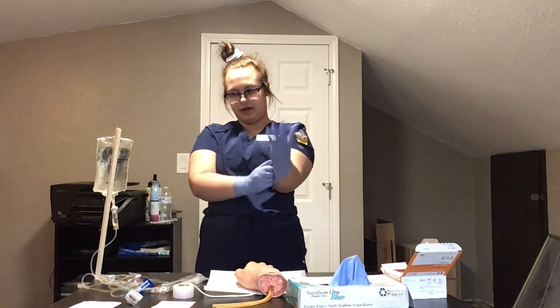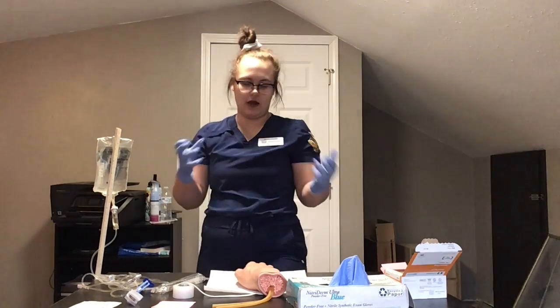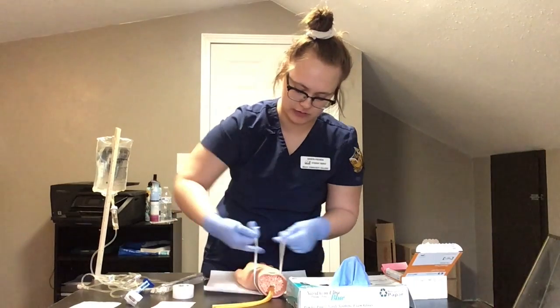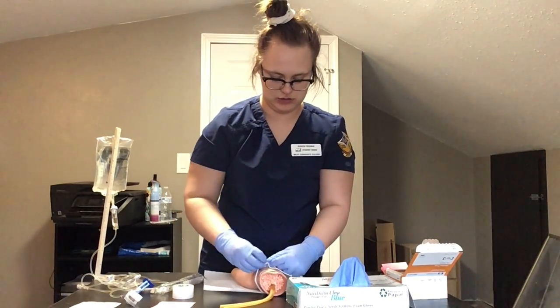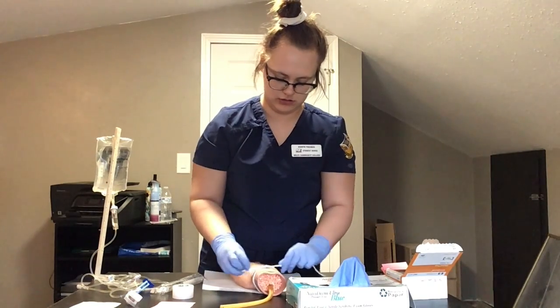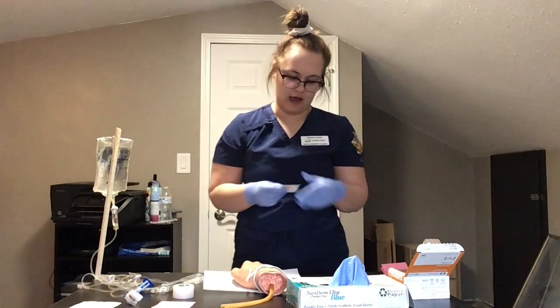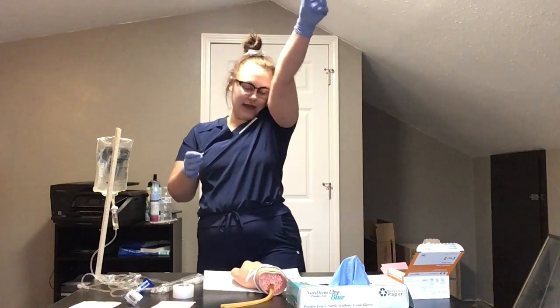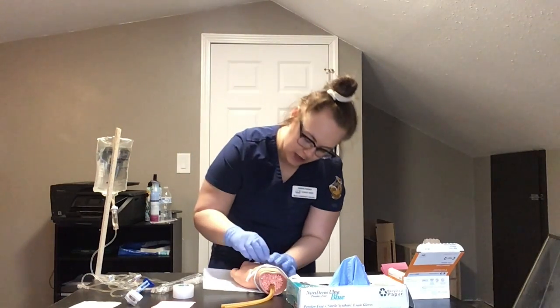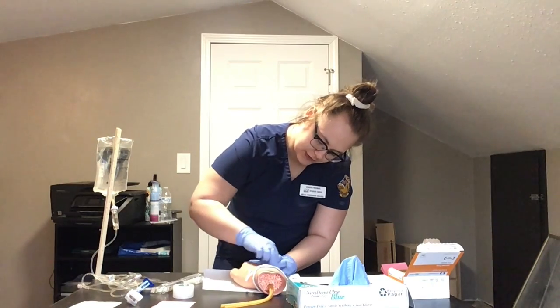I have all of my supplies ready. I've got my gloves on, and now I'm going to reapply the tourniquet. Okay, tourniquet is on. I'm going to get an alcohol prep pad, and I'm going to cleanse the site, starting in the center and working my way out in circular motions.